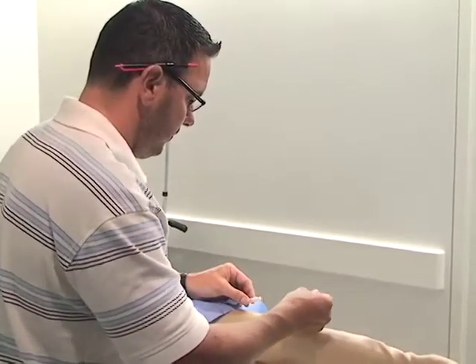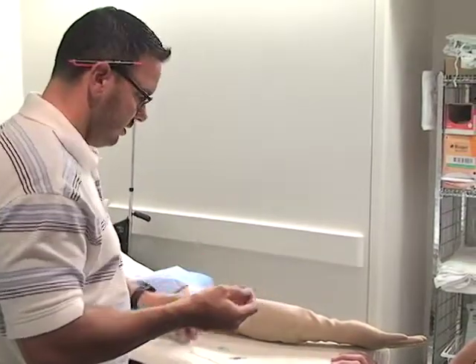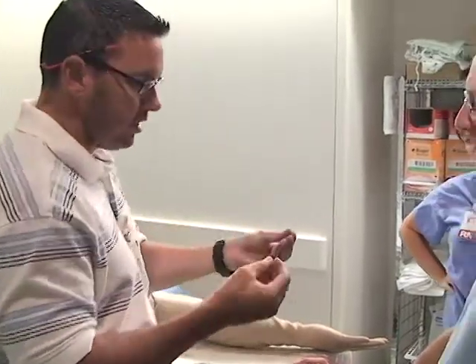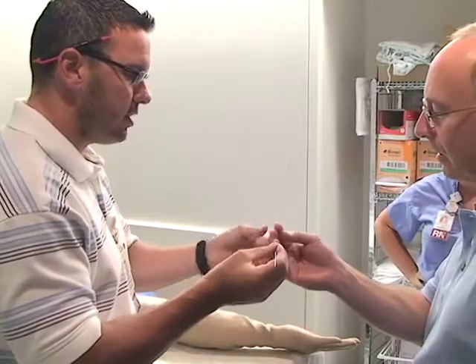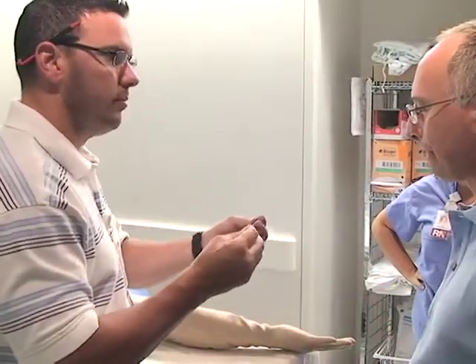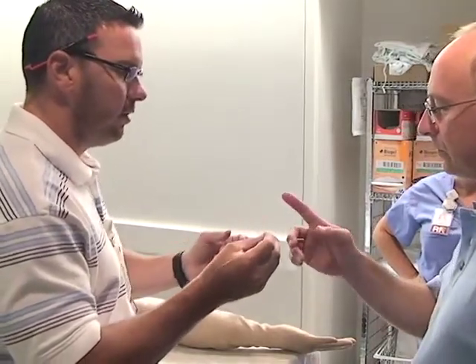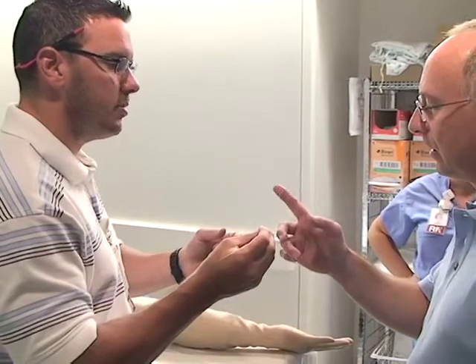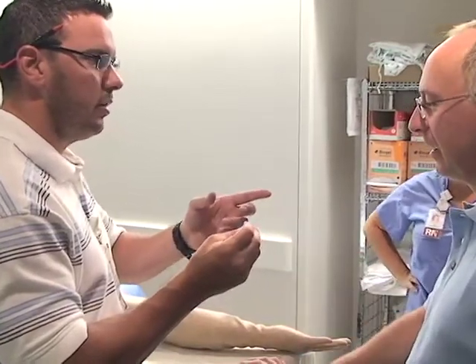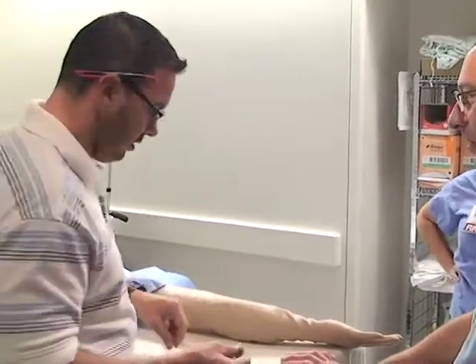Doesn't that wire poke through the vein? It does not. If you feel how stiff that is, the back end of the wire is very stiff, and that probably would poke through the vein and do some injury to the intima of the vein, but feel how soft the end is. See? When it meets resistance, it just curls up. Good question.